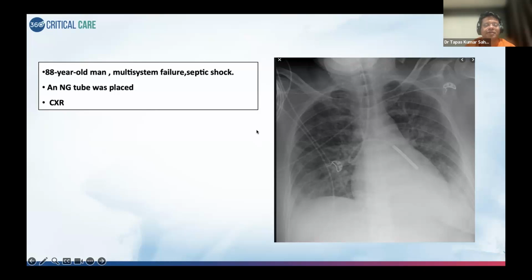Yeah, okay. So answers are getting a little bit better framed now, but yes, you still need to improve your answers because you all know it. I am not saying that this is a very uncommon X-ray. Everybody has seen this X-ray, but how to answer it in the examination, that is the trick. And in this webinar and all of our courses, we try to give you a structured approach.